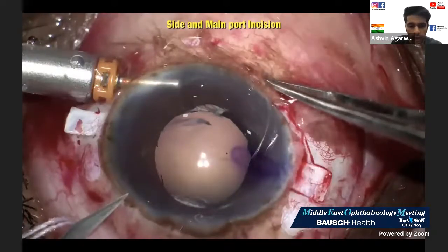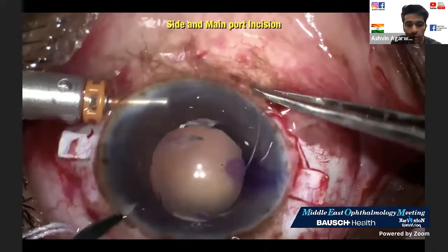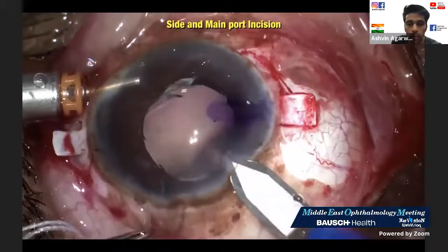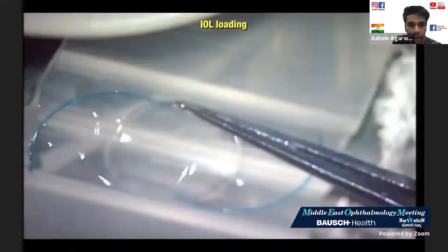I next make my corneal incisions. One is a side port entry on my left because I'm a right-hander. And on the right side, I make my main port incision where my intraocular lens will be inserted. Next is my load. Sorry.